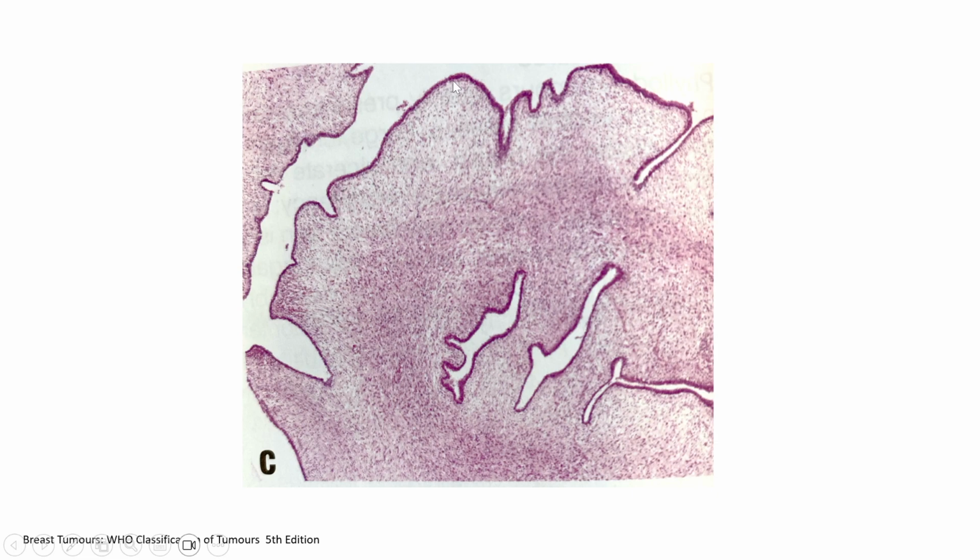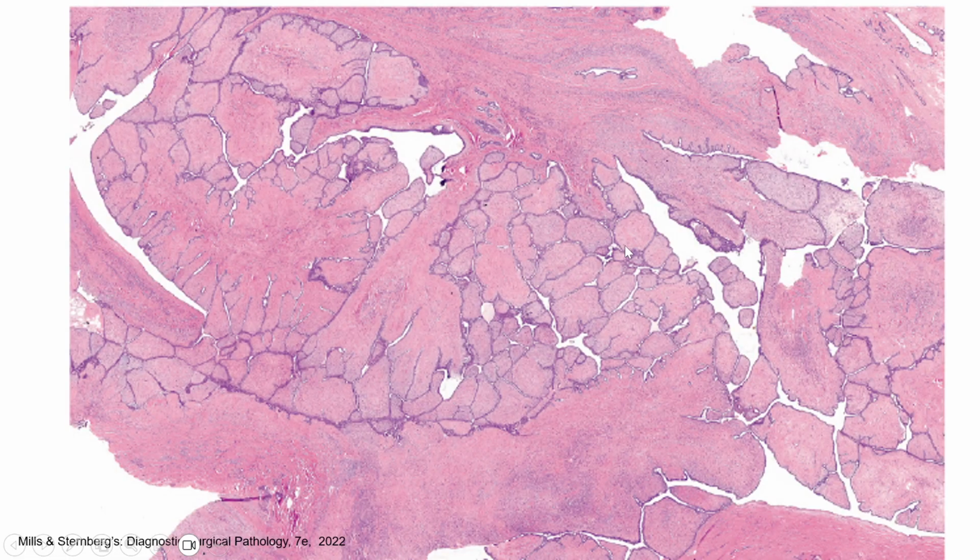That means close to the epithelial area, we can see it's bluer, more blue than this area, because we have more cells just next to this epithelial. When you see this feature, you can be suspicious for phyllodes. But of course, sometimes if you see this hypercellular stroma, you just could not tell whether it is a stroma from a cellular fibroadenoma or a true phyllodes. This slide is really good to show this leaf-like structure.